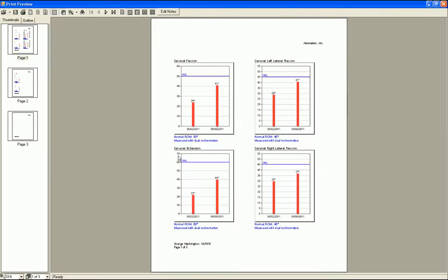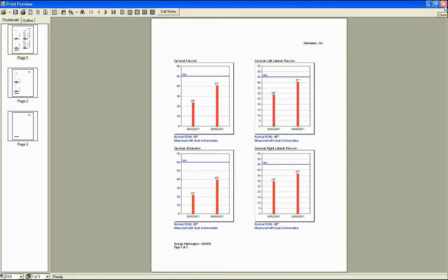The Short Session report was created in response to our users asking for a shorter, more economical report that could be used for patient education. While the Long Session report utilizes one page for each test, the Short Session report displays four tests on a single page. The report comes in graphical format only, and is great to hand to the patient after his or her visit to show their progress and also perhaps discuss room for improvement.